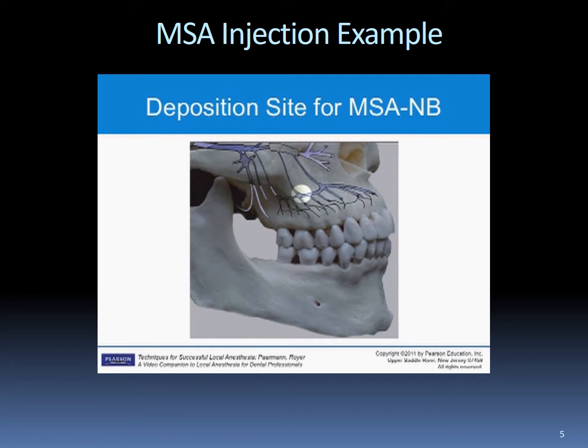Deposit the anesthetic slowly and consider depositing slightly more anesthetic than usual, 3/4 to a full cartridge, since the bone is thicker in that region. Be aware that ballooning of tissue may appear in this situation and is normal to observe.